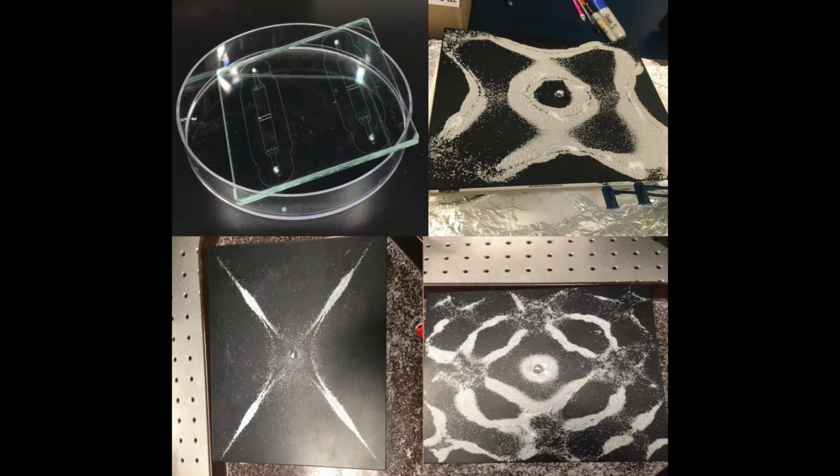Both the ANSYS and microscale device showed best focusing at a 75-degree angle. Overall, the microfluidic device showed a significant amount of success as compared to expectations. If we show best focusing in the same frequency and angle as predicted in ANSYS analysis, that confirms that the analysis accurately represents the physical design.